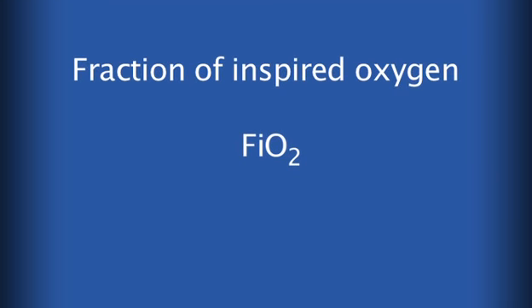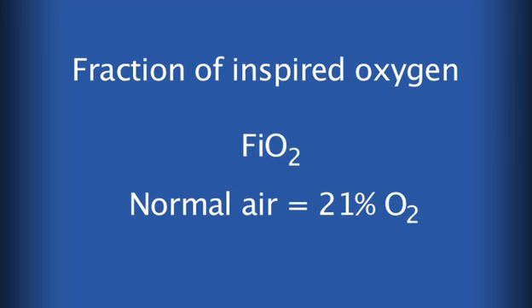We have so far mentioned that room air contains 21% of oxygen, so the FiO2 is 21%. Although the concentrations given are only approximate, you will see that if you have a pulse oximeter, you can titrate the oxygen therapy to the patient's needs by changing devices or changing oxygen flow rates depending on the patient's oxygen saturation. In the appendix, you will find a useful summary of the inspired oxygen concentrations provided by the different flow rates and devices that are shown throughout the following section.